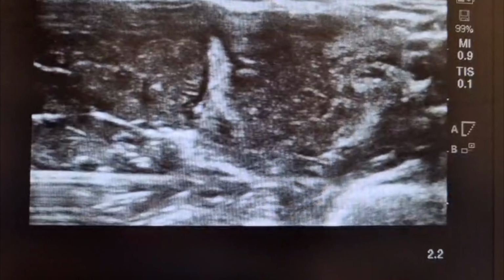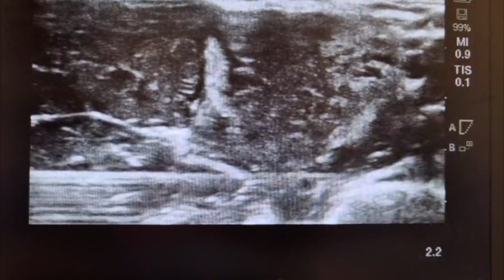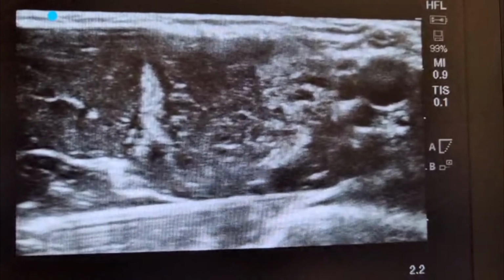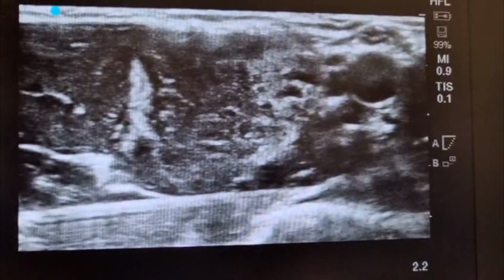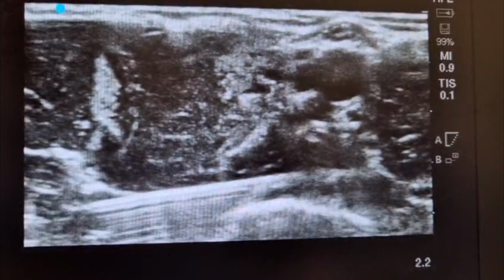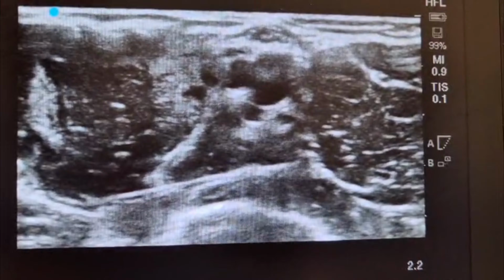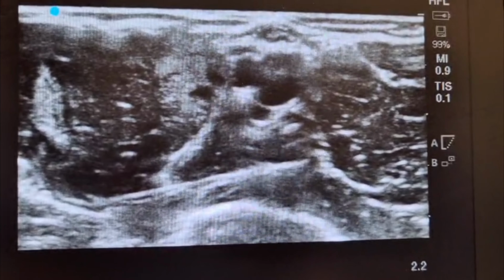Yeah. So while you're going, wriggle the needle. So roughly, if you don't see, you will feel it. Give a little bit more pressure on your probe. Okay, that's good. That's good. So if I can see the tip, yeah, aspirate, yeah. That black bit is quite safe to inject.